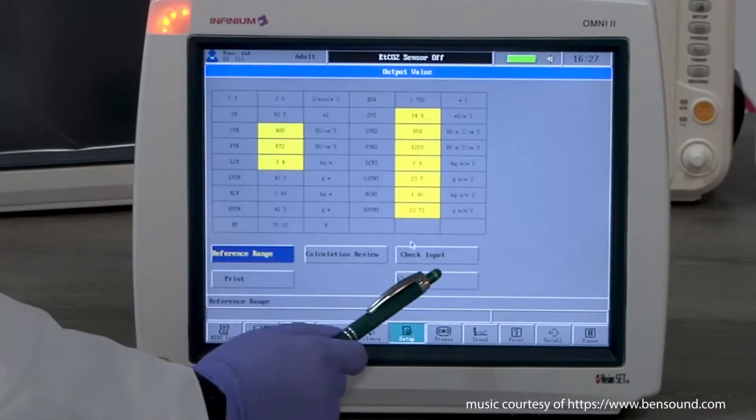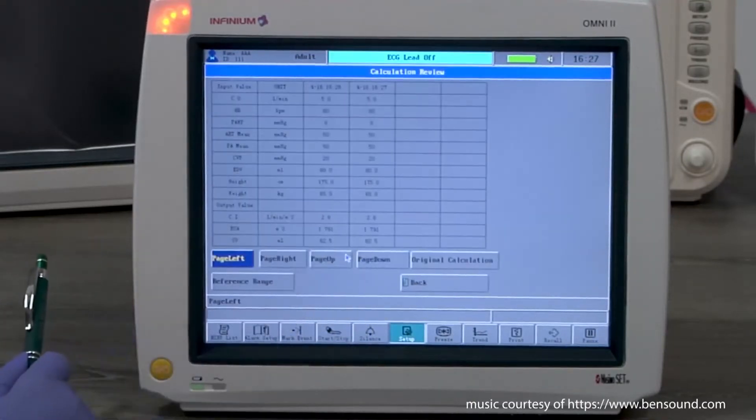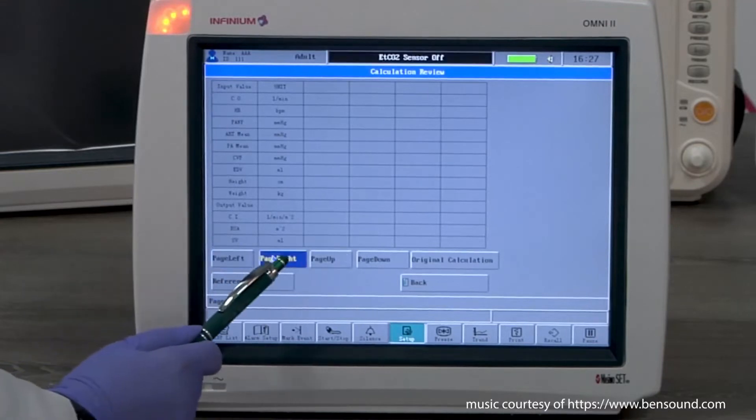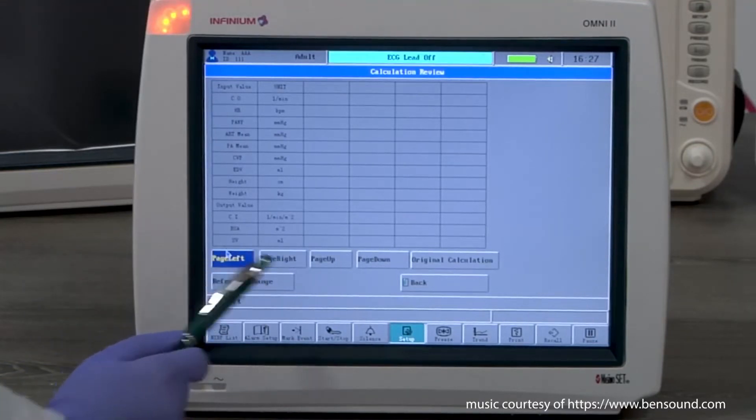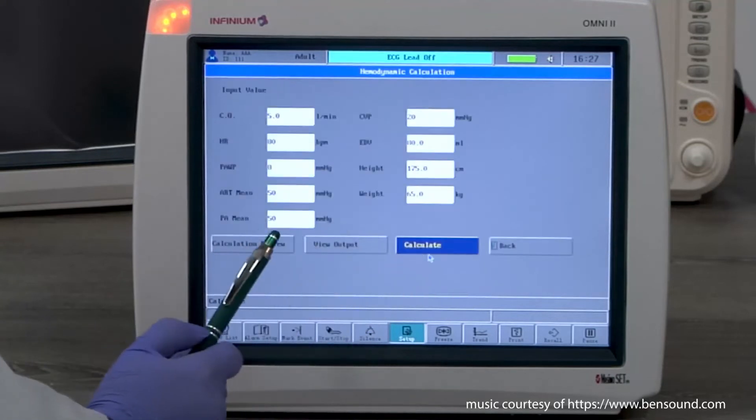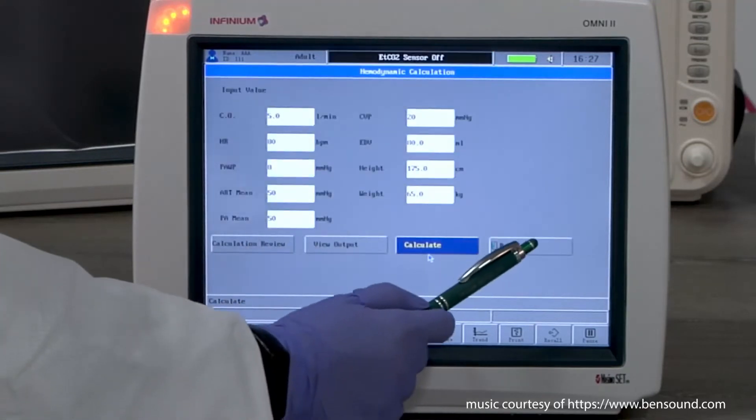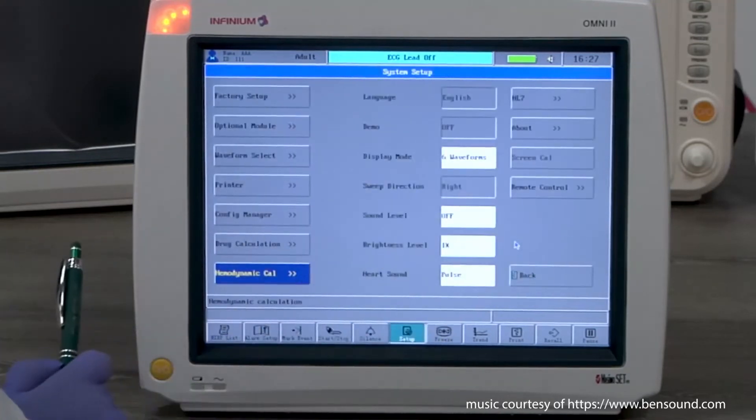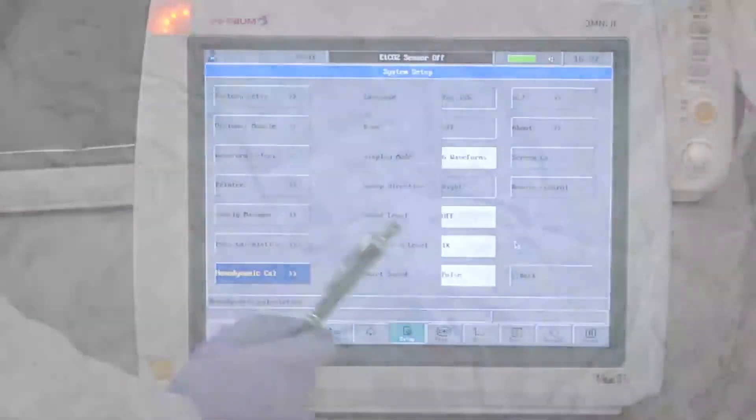If you have done multiple calculations, you can check calculation review to see the history. This table can keep up to 12 records. On this page, you can select back to exit or select original input to check the input or start a new calculation.